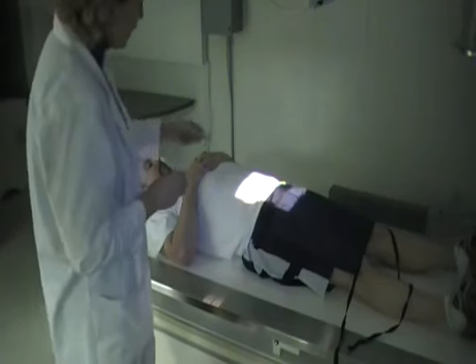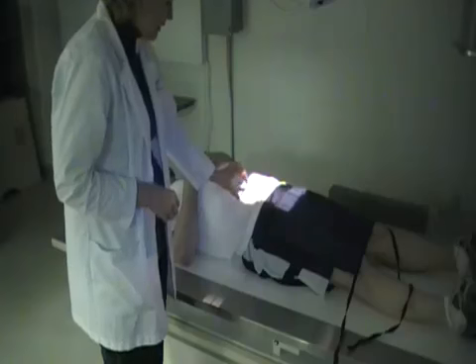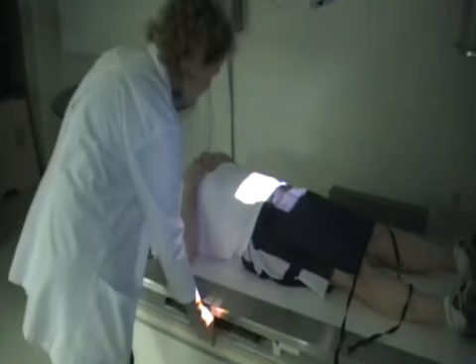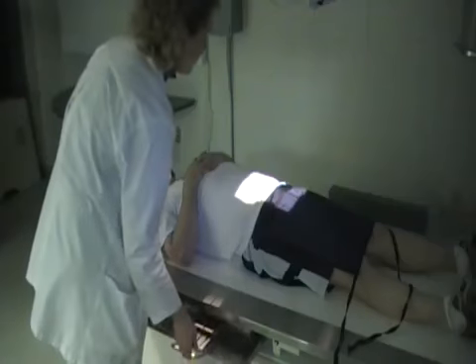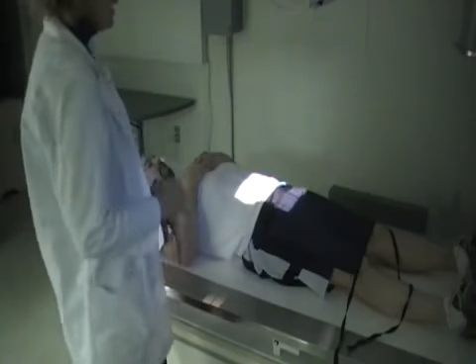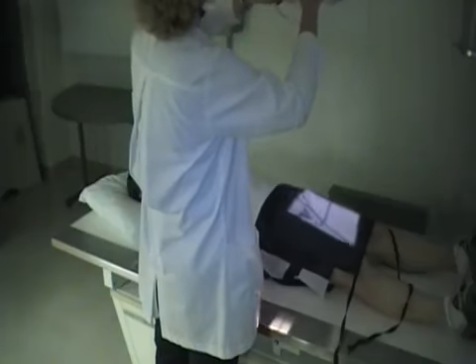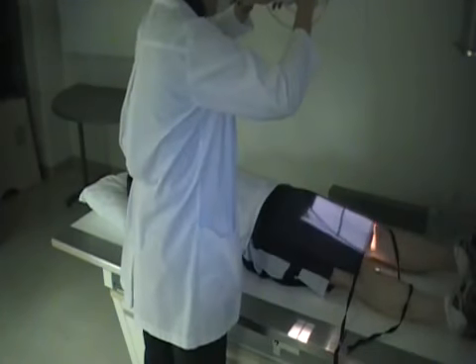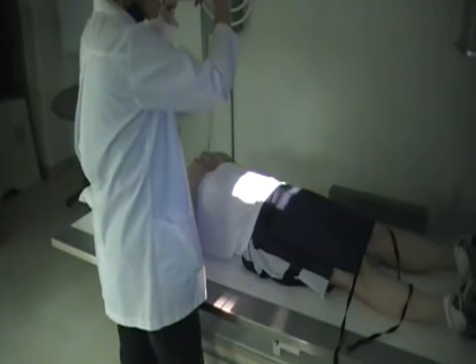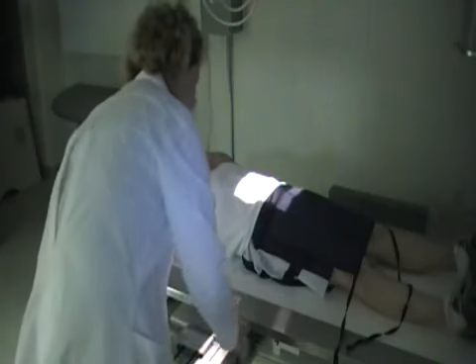Now, you can either place your right marker on the patient like that, indicating that's the right side, or you can place your right marker on the right side of the image receptor. Now, to do the AP axial of the coccyx, we're going to angle caudally 10 degrees. But our central ray is going to enter at the same point, 2 inches above the pubic symphysis.